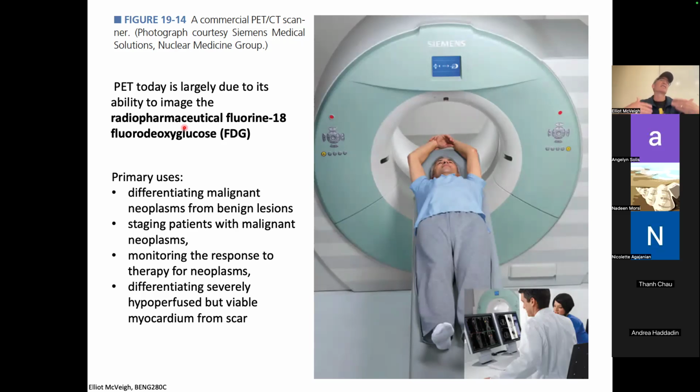And that molecule can get taken up like it's a sugar or like it's an ion through a sodium-potassium channel or something like that. And it will give you a picture of where the stuff went and a picture of how the tissue responded to the stuff when it got there. Like, did it take it up or just spit it out?